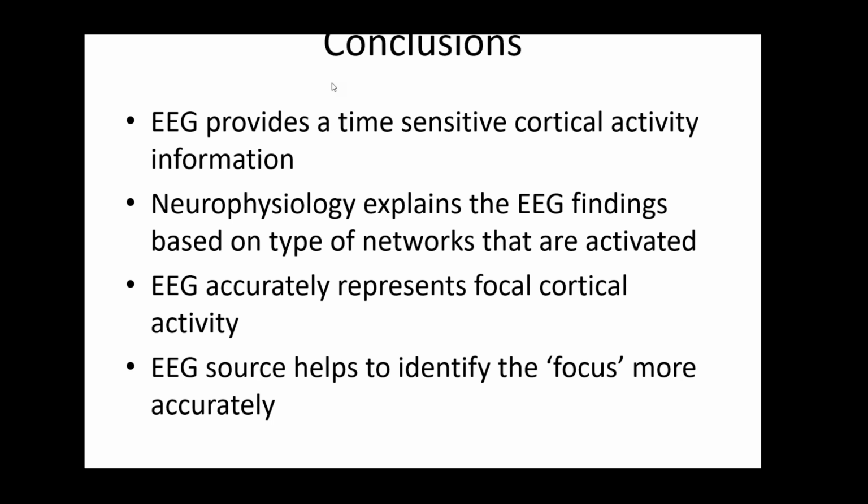So both are about the same. I use both: the dipole model, and I use sLORETA as the source localization. Particularly the moving dipole model, which is the most commonly used, gives you a dynamic.